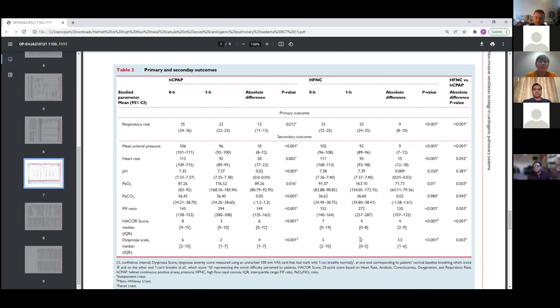Right. So I think it is very important to define the conditions, so what sort of intervention will be needed. For instance, if there is a proper acute respiratory distress syndrome, probably nasal cannula might not be as effective as oxygen under pressure. And in trust I've worked out that certainly CPAP would be your first line to go, and then high flow nasal may be something that you use on the wean down of the other side.